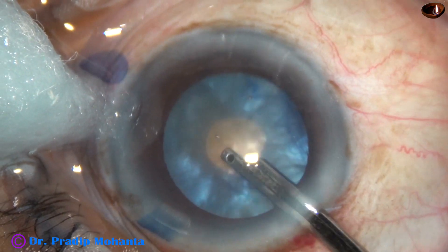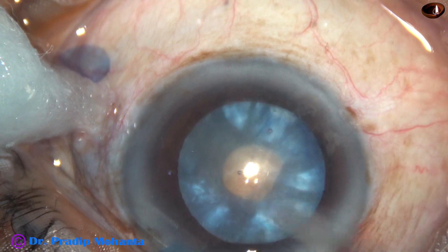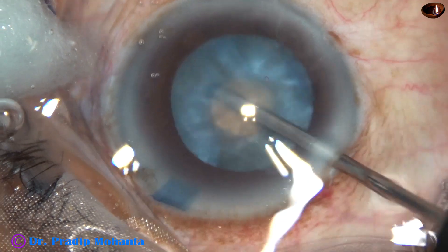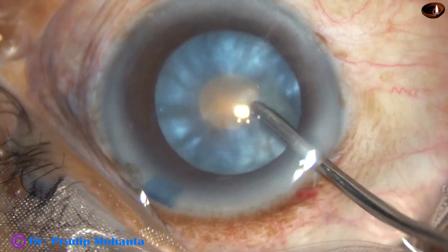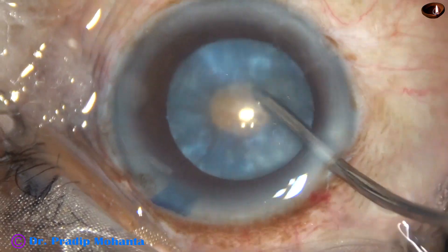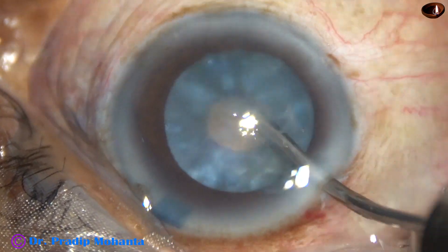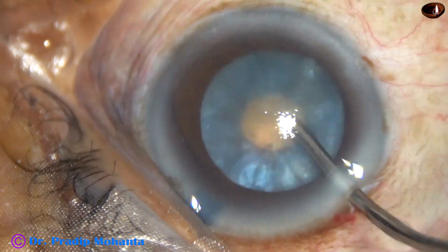We can use this instrument — a 23G Simcoe cannula — to aspirate some cortical matter. Or we can use bimanual irrigation-aspiration probes, rotate the lens and move the lens sideways. After some time, cortical matter will come out through the opening and through the incision outside. In this way, the intra-lenticular pressure can be drastically reduced.